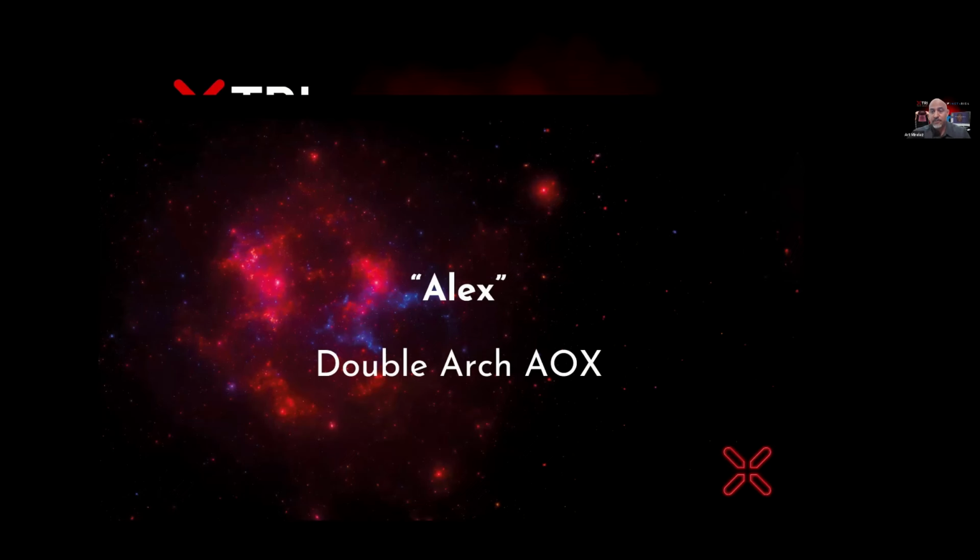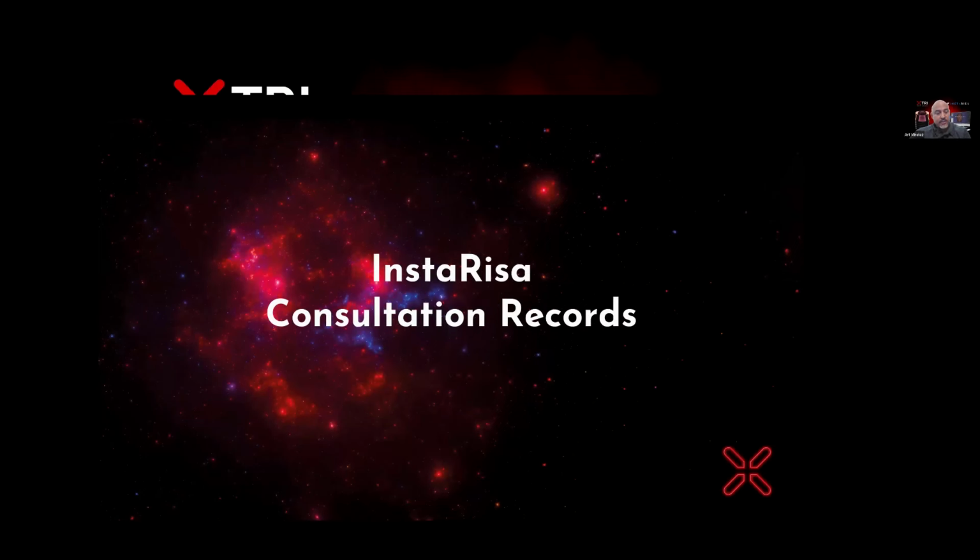This is a TRI specific case. This is Alex, and this is the toughest type of case, right? I didn't cherry pick. This is a double arch all-on-X case. So let me introduce you to Alex. The first thing we do in our practice is our consultation records. We take photos and we get a 3D facial scan that takes about 30 seconds, and that really wows the patient.